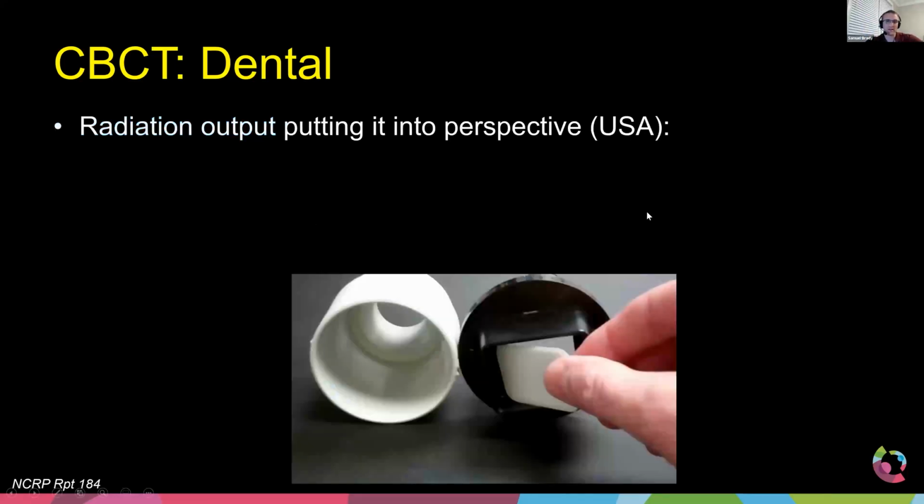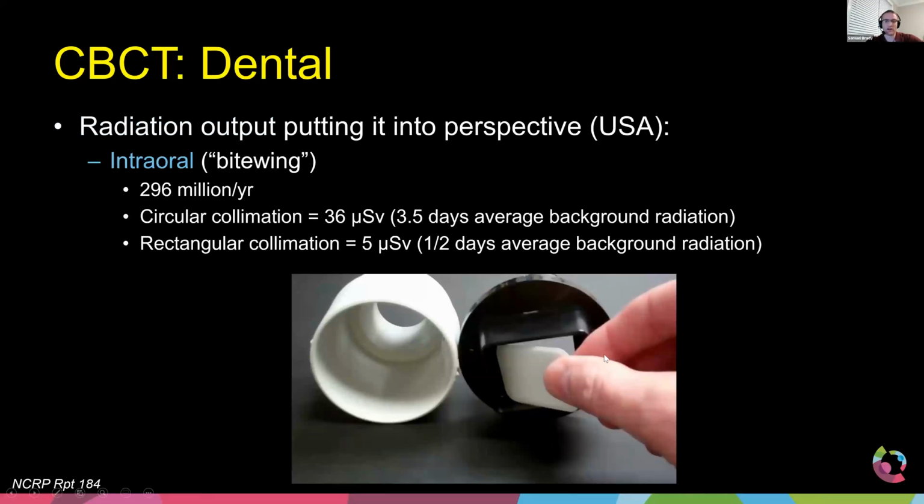All right. So let's also try to put this a little bit into perspective. Now, I know we don't use effective dose when we do diagnostic reference levels. So really what I'm trying to do is just talk about the previous screen, where the doses were machine doses. They were machine output, stuff you can measure with an ion chamber. Now, how would you equate that to patient population dose or risk?